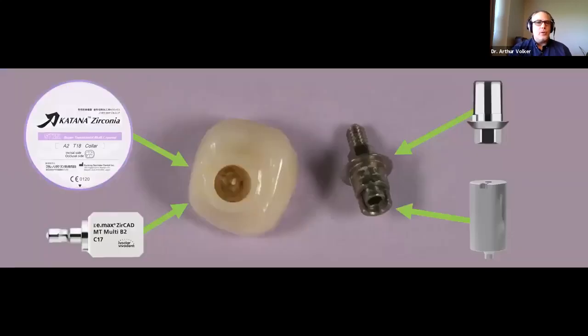And just to show you that you can actually do this in your office, if you consider milling, you can do it with a stock tie base, and you can mill your zirconia. Or if you're up for it, even a lot of the wet mills today allow you to make a custom abutment. And they have to be milled wet, though. So please just keep that in mind.